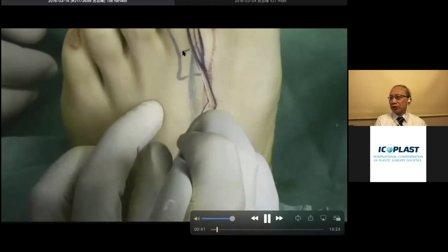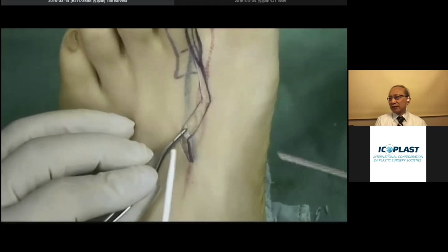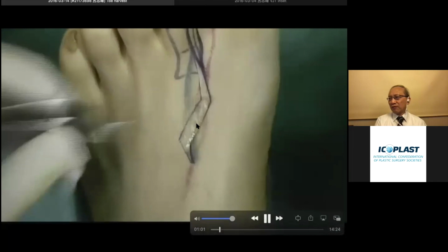So at the beginning, we were dissecting the superficial vein first. Of course, as we said, the superficial vein is definitely not just at the subdermal layer. These vessels are too tiny for the anastomosis. So the larger superficial vein will be a little bit deeper, under this subcutaneous layer.